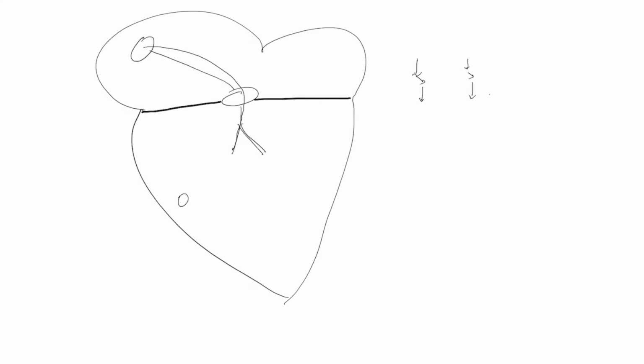But then at this point, something happens in the ventricle. Because the impulse isn't following through the most efficient pathway, the waves of depolarization spread haphazardly, and so you would have a weird looking QRS. So let's say it looks something like that. So you have the wave spreading back, and then it kind of stops at the AV node. And if this is the case, the next P wave might not necessarily be able to cause a ventricular contraction, but the P wave after that would pass through the AV node and cause a normal QRS to happen.